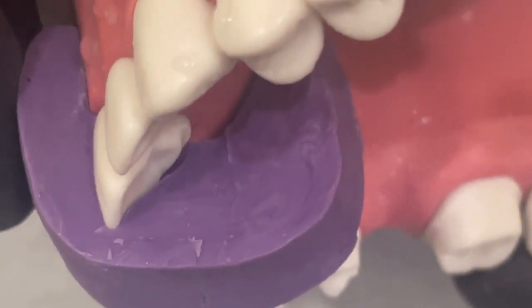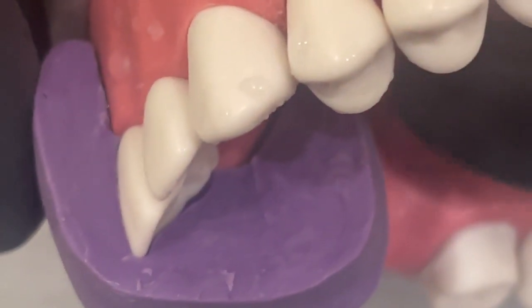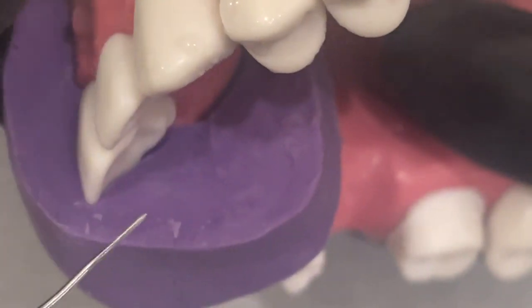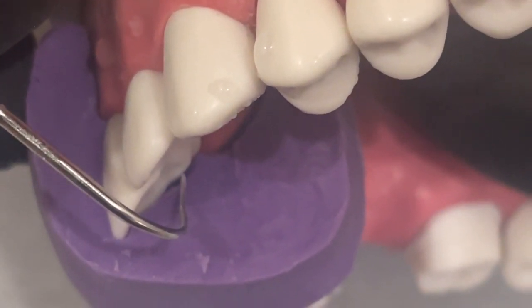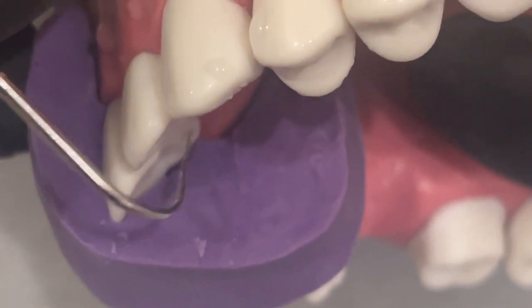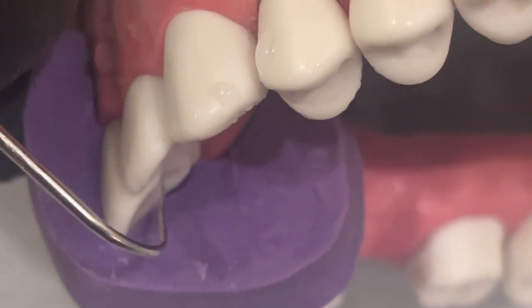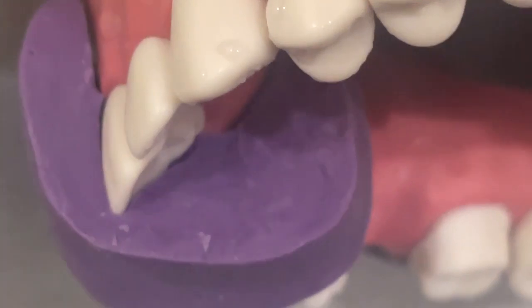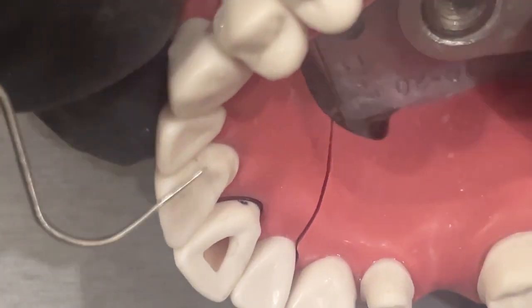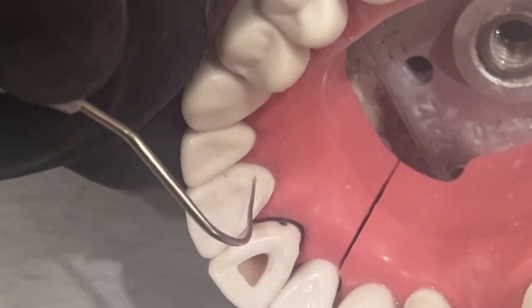Here's where I am so far — you can see how much distance I have from my cingulum. With my putty right here, I've created enough distance, and then I have to drop down into that one millimeter wall. I could probably reduce a little bit more, but this is just a quick rough cingulum video. The tooth itself is very flat in the cingulum area, so as you're prepping you almost have to force the creation of this shape.